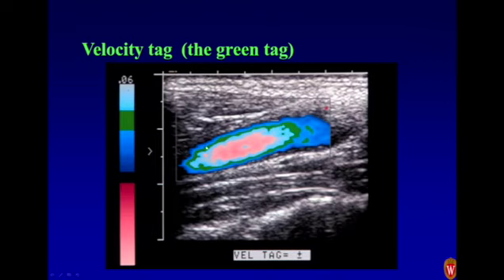Then we come into a little lighter hue. Then we got the green tag here, then the light blue, a little more central, and now we're even aliasing to the pink color, and then deeper hues, so you can see how many lamina this image is projecting for you.